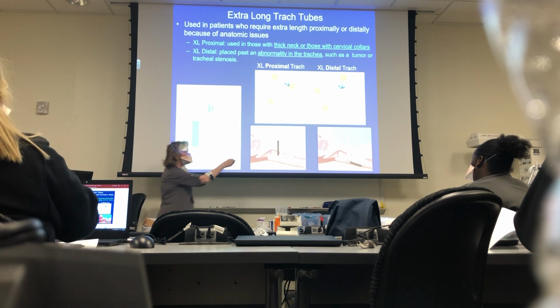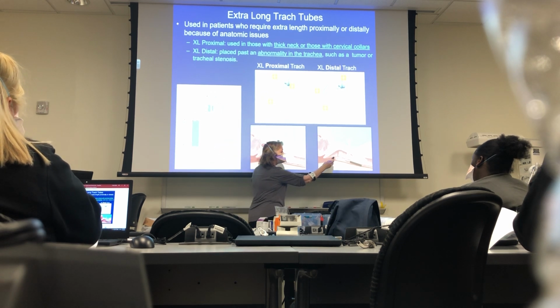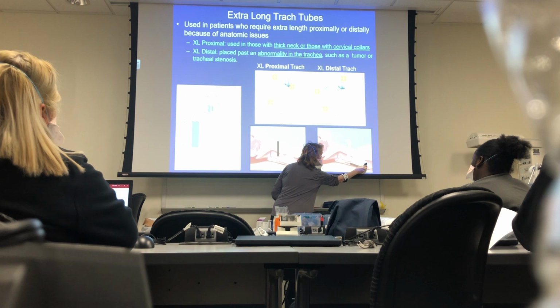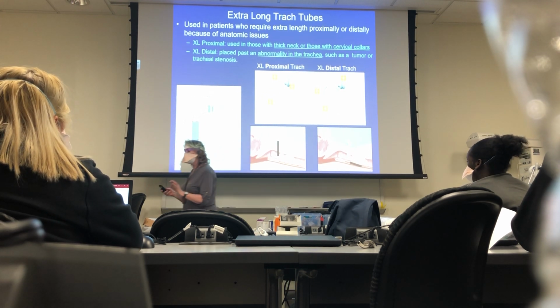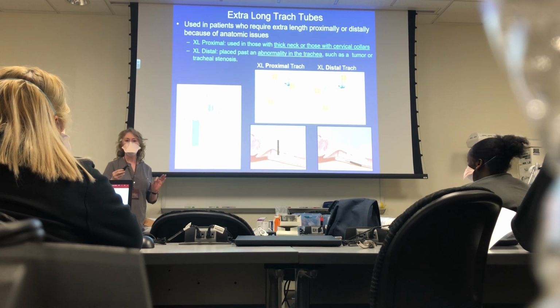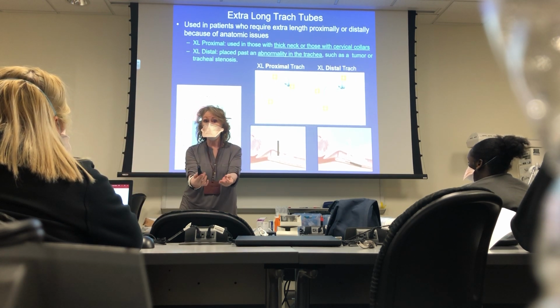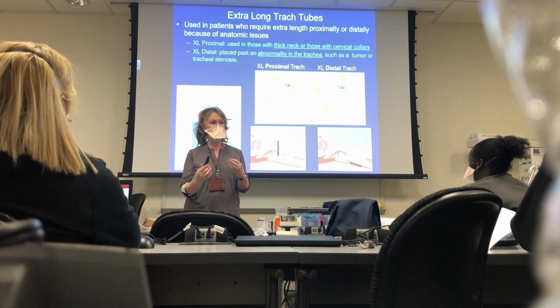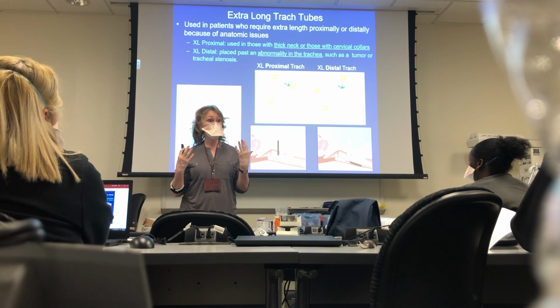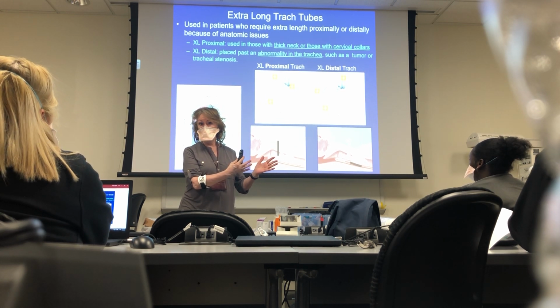So you can see this one is long. This is the extra long proximal. From here to here to the elbow is much longer. Here, this is much longer from here down to here. So you would only think about those if you're a therapist in the ICU. It's the physician that needs to know from you, no matter what I do, I can't seal this cuff, I'm losing volume, patient has a very large neck, maybe we should try an extra long proximal tube.